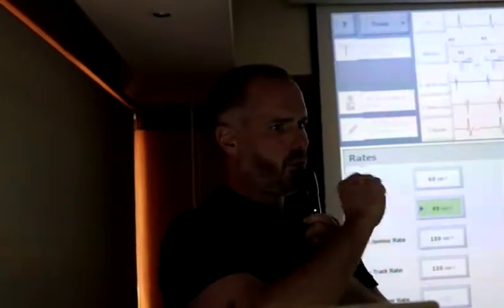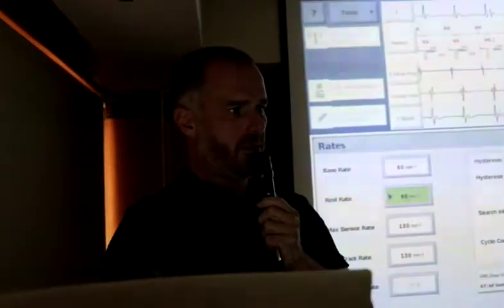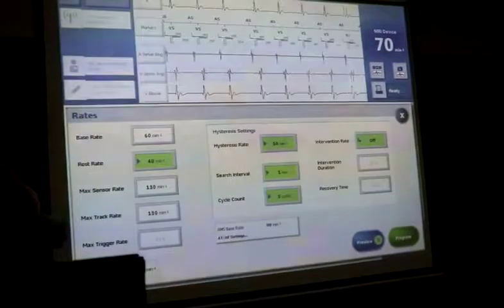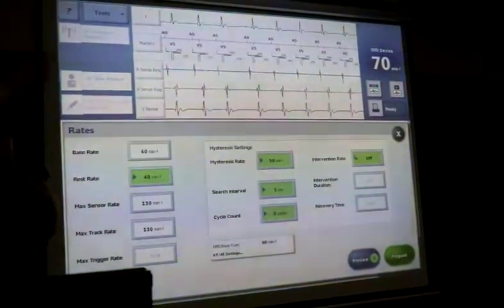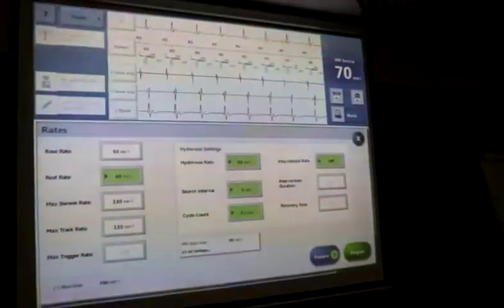On a patient like this who had good SA node activity, I would maybe even do 20. And some people would just put this at 40, right? Or even 30. Because if you have a normal SA node, it's not diseased, so leave it alone. We're just tracking it, right? So there's an argument for just not being complicated.